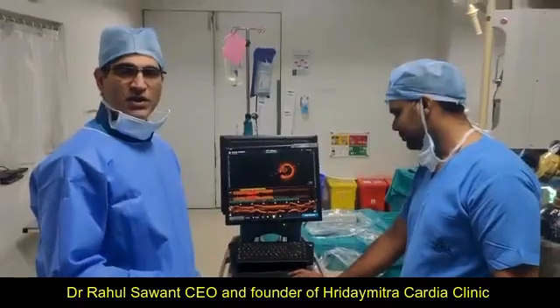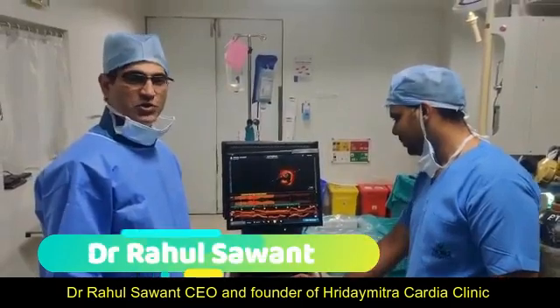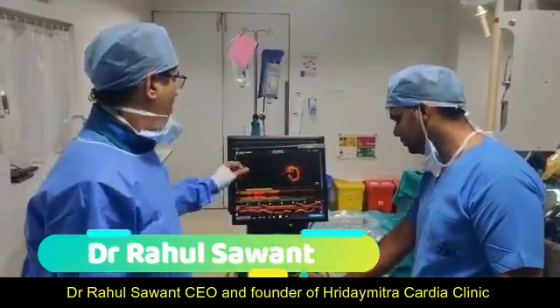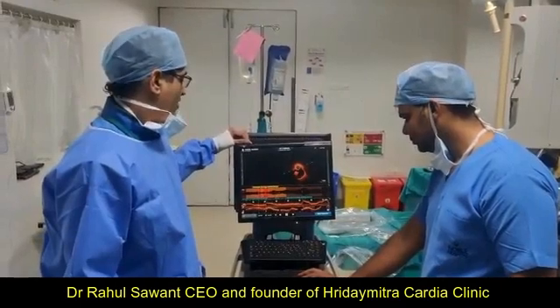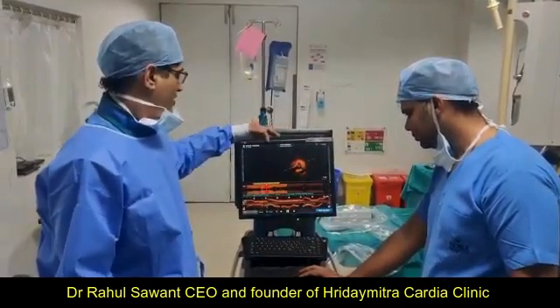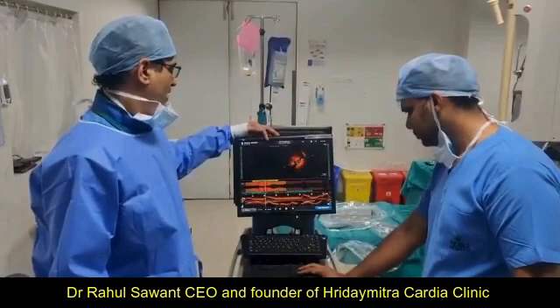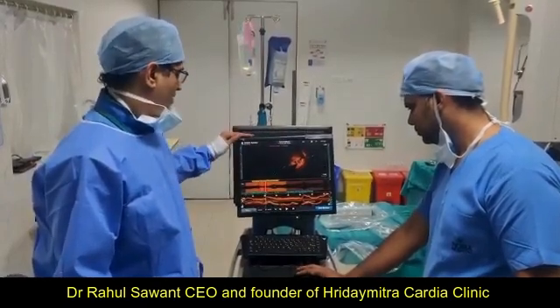We have done angioplasty using OCT technology today. You can see here a run of the coronary vessel from inside the vessel. You can see the blockages here — we will explain it. This is before doing the angioplasty.